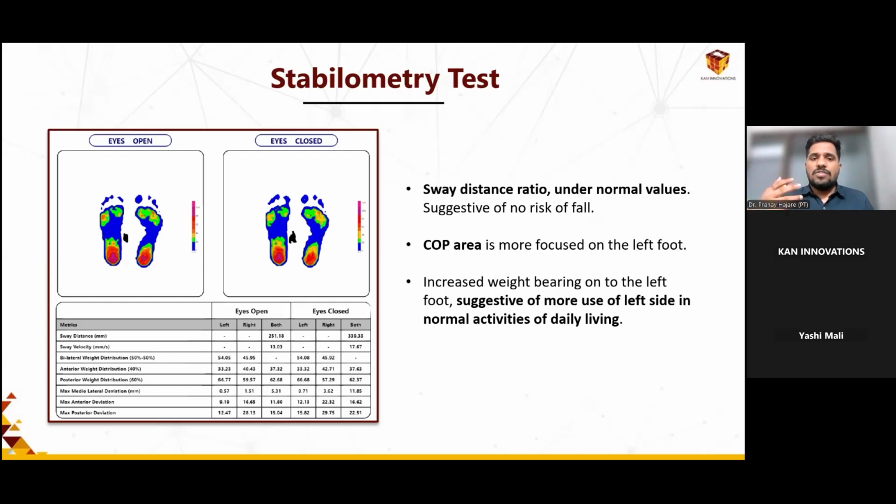Medial lateral sway naturally increases due to these reduced stability margins. Eyes closed with a narrow base is the most sensitive condition to detect subtle sensory integration defects. Excessive sway suggests proprioception or vestibular deficiency or dysfunction.